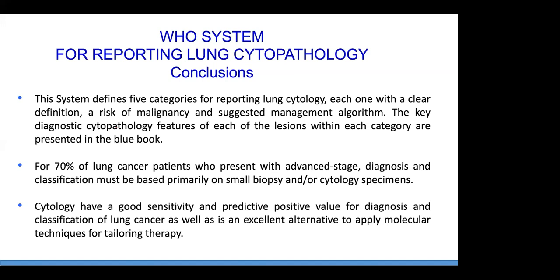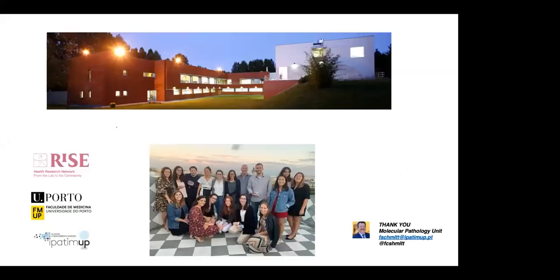Remember that 70% of lung cancer patients present with advanced stage, so the diagnosis and classification of lung cancer must be based primarily on small biopsy and/or cytology specimens. Cytology has good sensitivity and positive predictive value for diagnosing and classifying lung cancer, and is an excellent alternative for applying molecular techniques for tailoring therapy. So thank you very much for your attention.